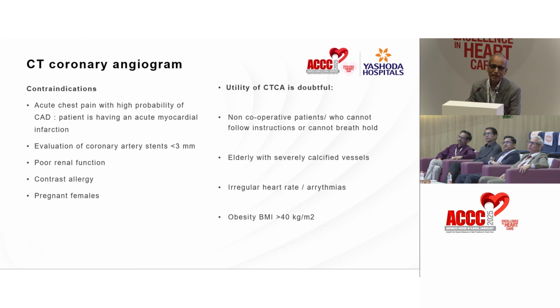One significant limitation of CT coronary would be in patients who can't hold their breath or who have severe arrhythmias, where you don't get good angiogram-like pictures. And severely calcified vessels are again a problem, where the sensitivity of the test would be less.